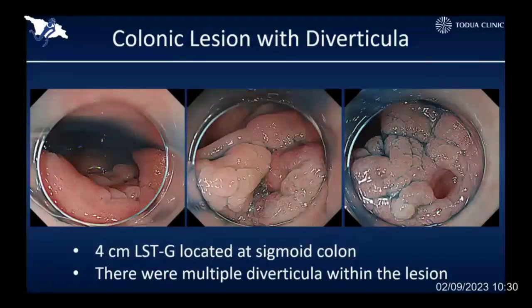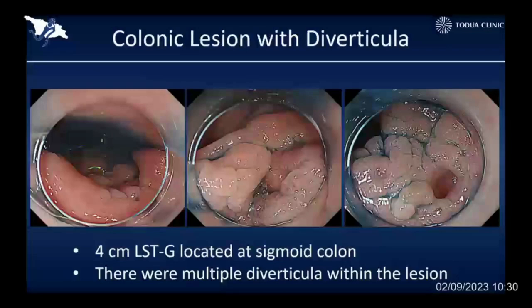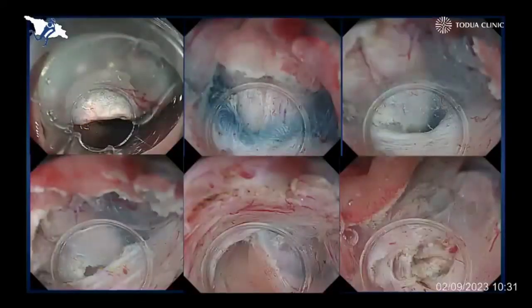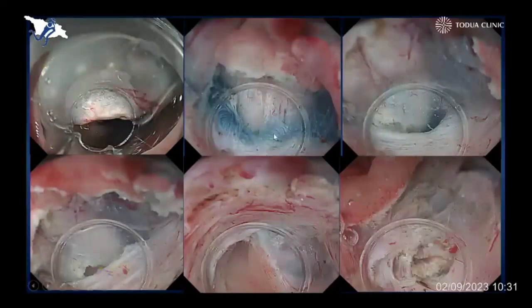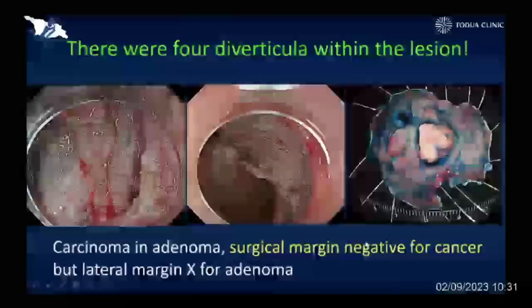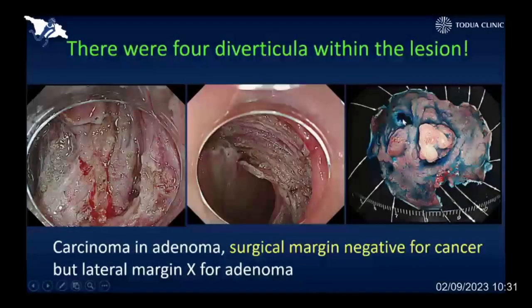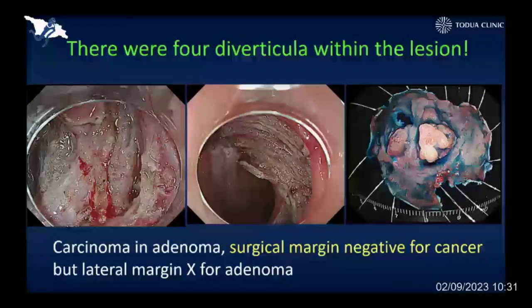This is such a case. This was not a big lesion, but there were multiple small diverticula within the laterally spreading tumor — a really challenging situation. I carefully conducted submucosal dissection and exposed the tumor tissue going into the diverticula, and carefully dissected the surrounding tissue around the diverticula. Finally, I removed the entire lesion. Some of the lateral margin became unclear for the adenomatous component, but the cancerous component was completely removed with free margins. Therefore, I believe this was a curative resection.